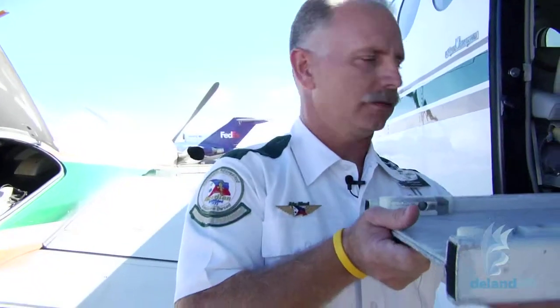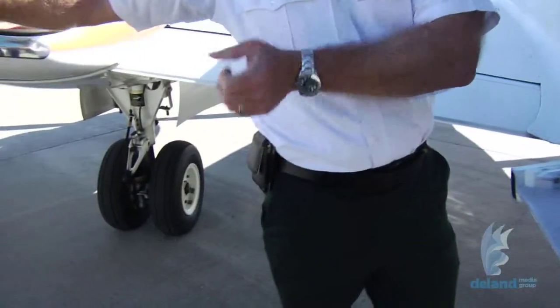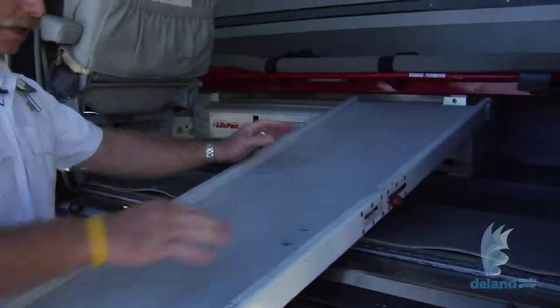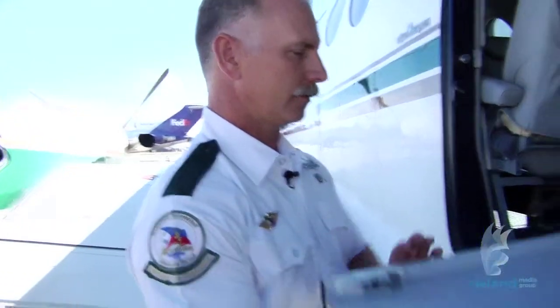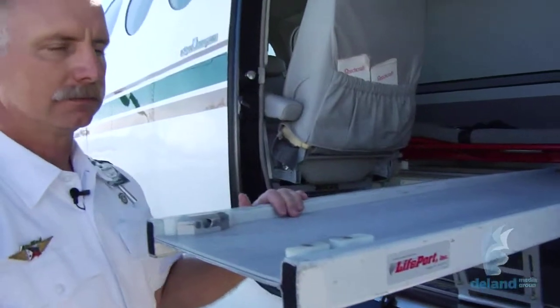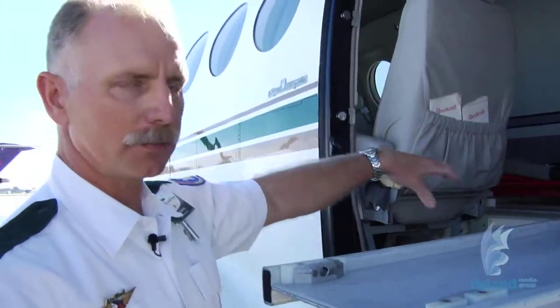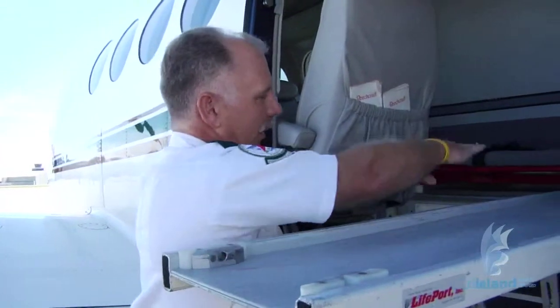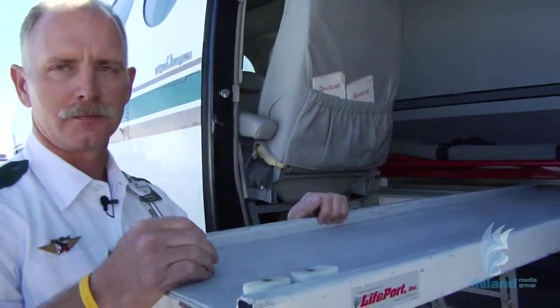the patient on the stretcher would be rolled up to this point, and then we would take this ramp and drop it down to the level where the stretcher is and just slide the actual stretcher from the ambulance onto this ramp. Once it's on this ramp, we would pick it up, put this foot down, and then someone is inside the plane and they will take the stretcher and actually physically maneuver it in place and lock it onto the life port.